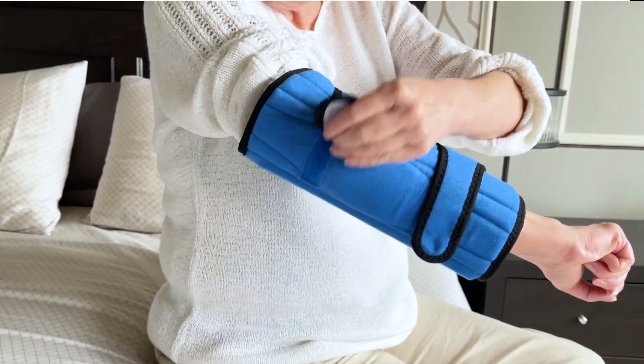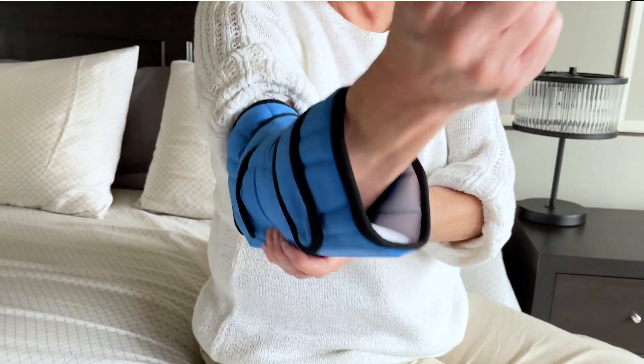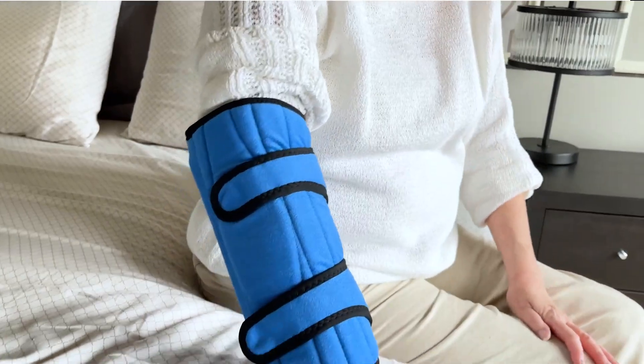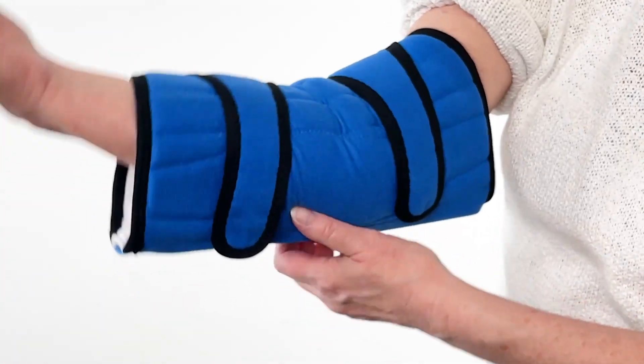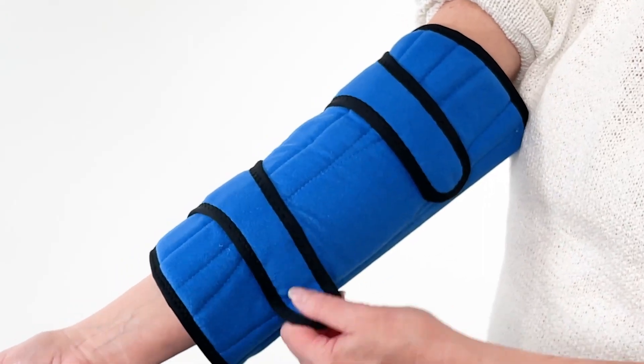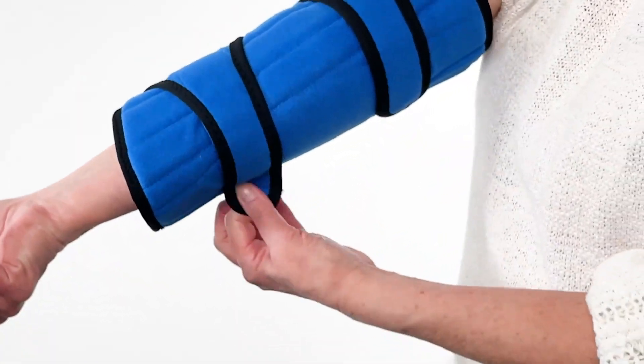After the straps have been secured, ensure the splints in the product are on the same side as your elbow. Check how the support feels during use. The product should provide compression without being overly tight or restrictive. Adjust fit by repositioning straps until it feels comfortable enough for all night wear.